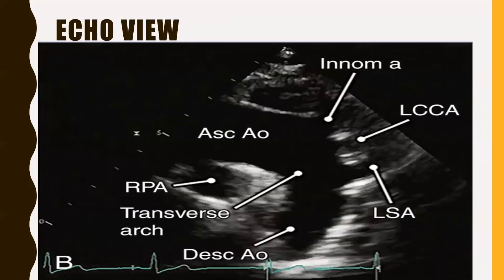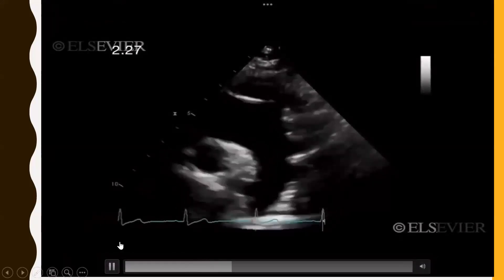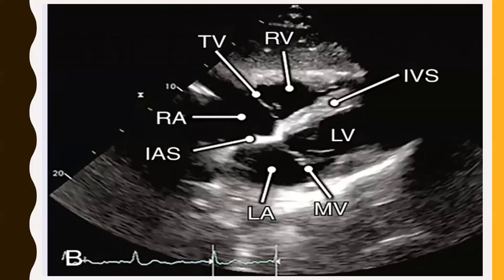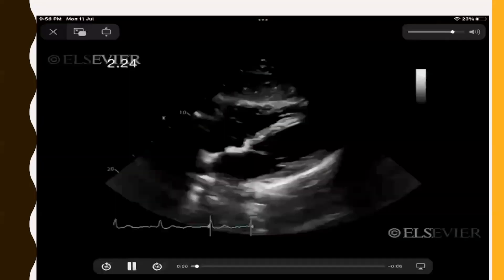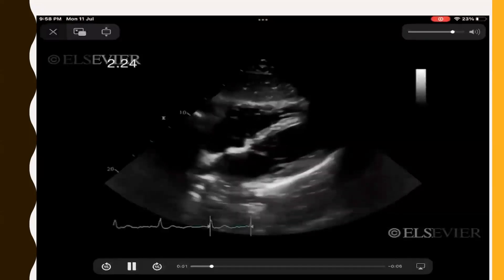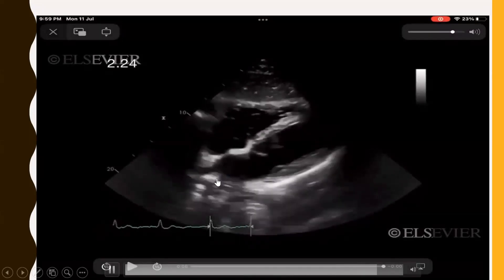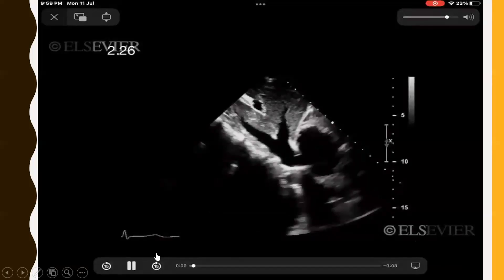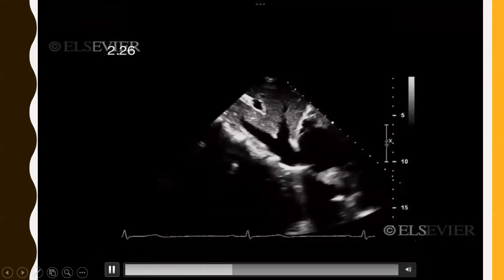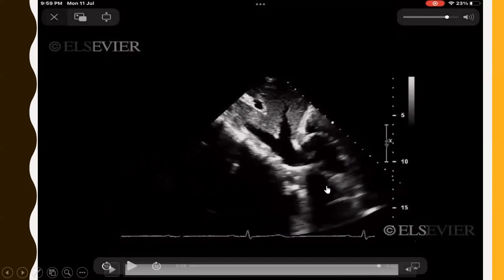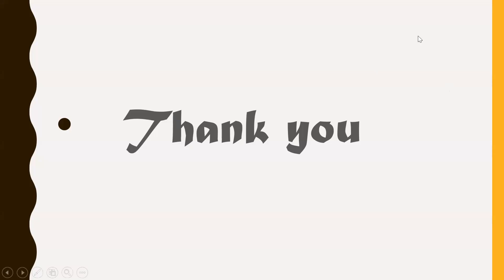The suprasternal view shows the aorta and its branches. The subcostal view shows LA, LV, mitral valve, RA, RV, and the tricuspid valve. The subcostal IVC view shows the IVC and hepatic vein merging and opening into the RA. This concludes the session; upcoming classes will discuss different valvular heart diseases and their echocardiographic findings.